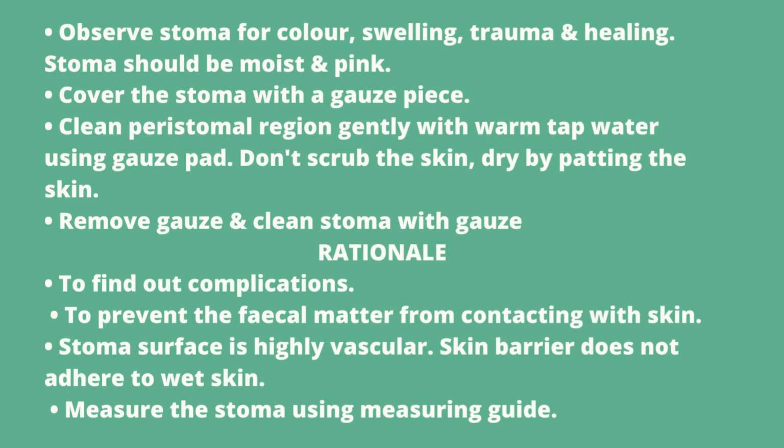so observe stoma for color, swelling, trauma and healing. Stoma should be moist and pink. Okay, so why we should observe all those things, color, swelling, trauma, healing? For what? To find out complications, right. To find out complications we need to observe all those things. Okay, cover the stoma with gauze pieces.